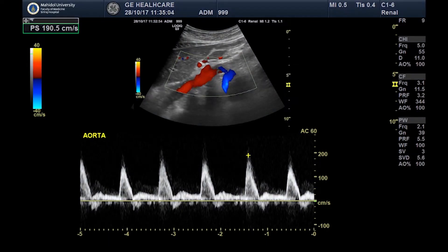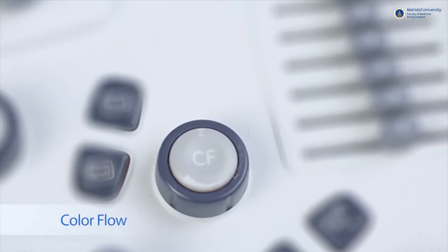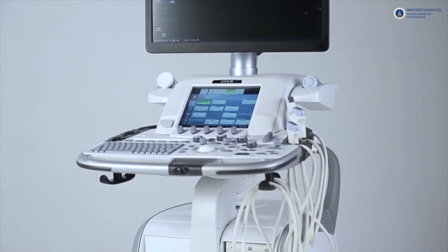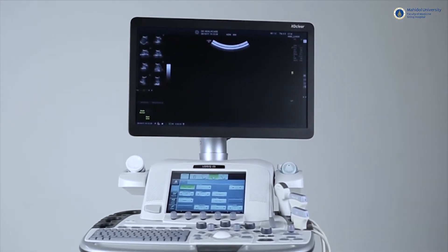For machines with color Doppler function, there will be additional color flow and pulse wave modes. It is vital to study your ultrasound machine's functions beforehand in order to obtain optimal images and to reduce any interpretational errors as much as possible.